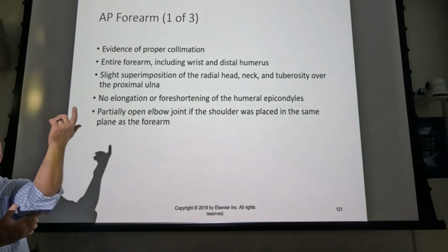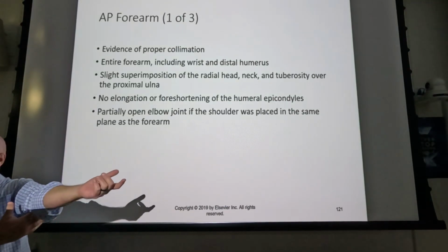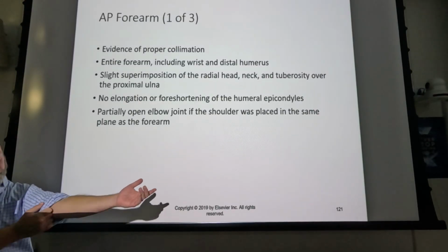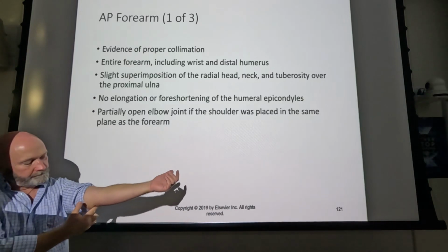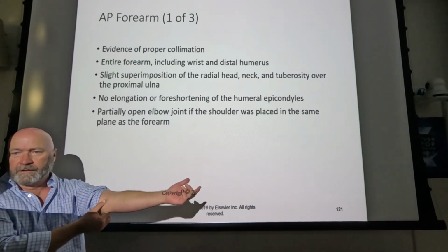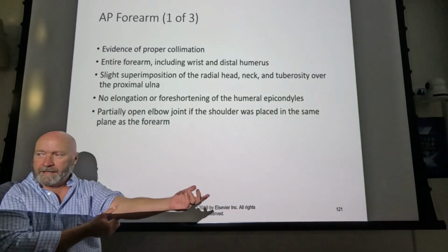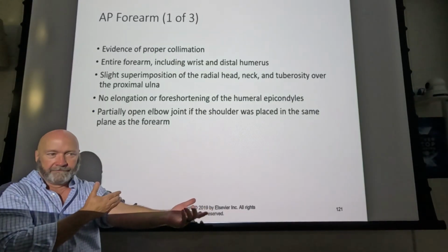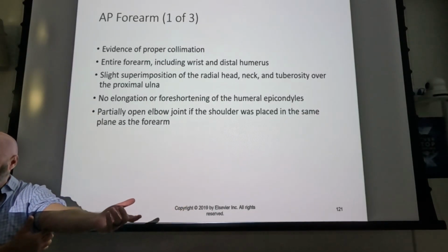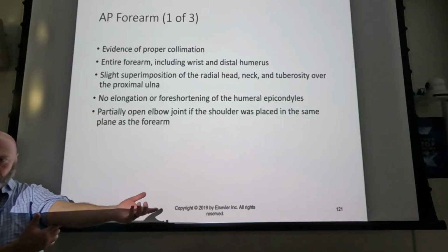You can kind of feel it when you extend your elbow, and it's right about here. So if it's right here, what am I getting into? Humerus, right? So your central ray needs to be the middle of the forearm, but your collimated field needs to be high enough that it includes the olecranon process.